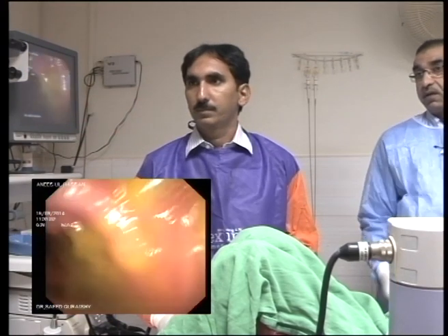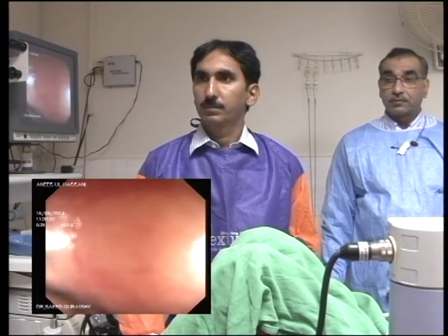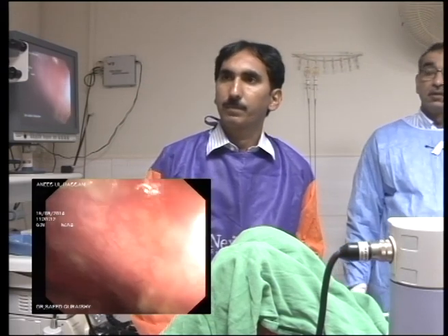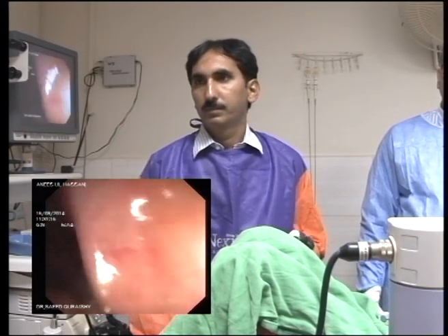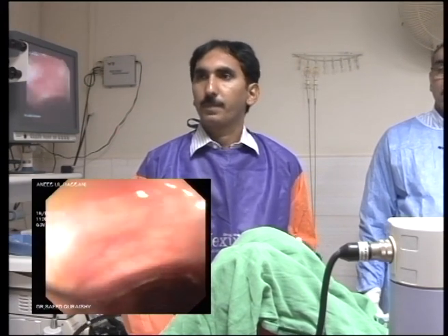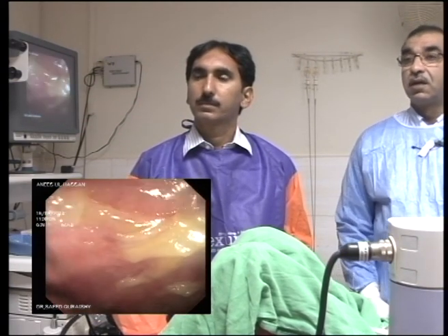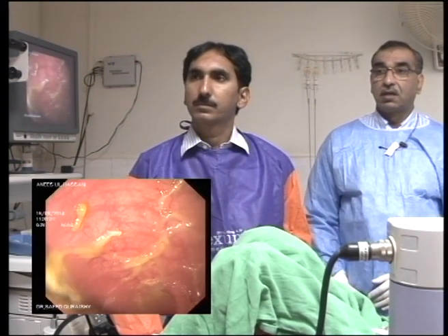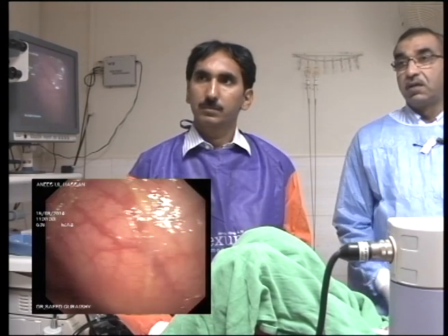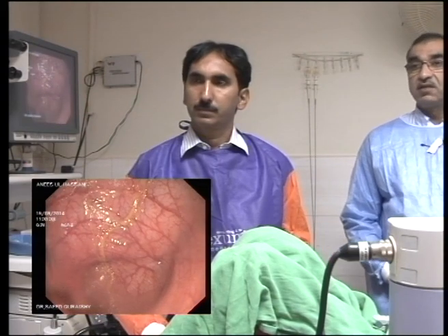Up, point away. That's it. हाँ. ठीक है? थोड़ा सा ज़्यादा हो गया. Get full luminal view, ऐसे ना जाए. ऐसे हाँ, that's better. ठीक है? That's good. Clear your lens.